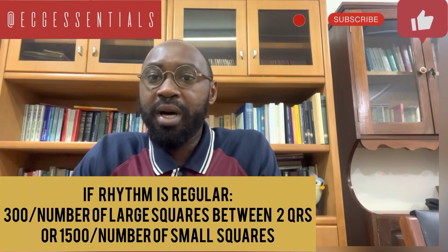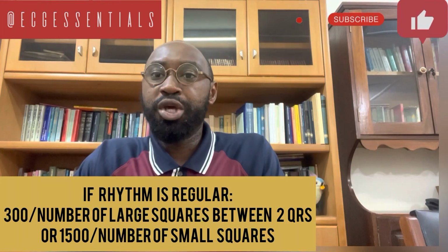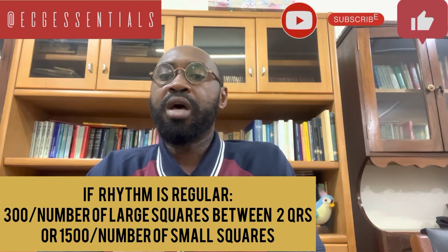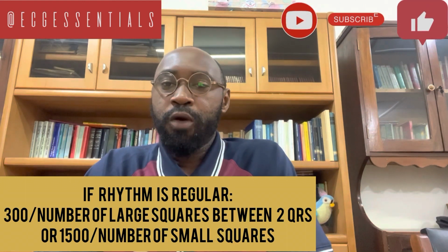Earlier, for those who have followed us, we discussed how to calculate the heart rate from the ECG. We mentioned that if the rhythm as we see it on the ECG is regular, then the easiest way to calculate the rate is dividing 300 by the number of large boxes between two QRS complexes.